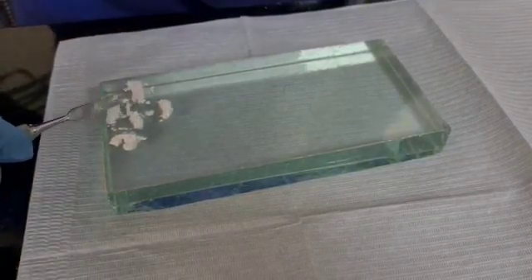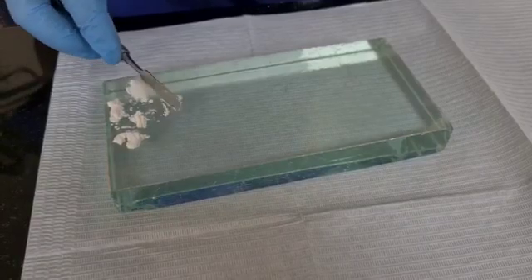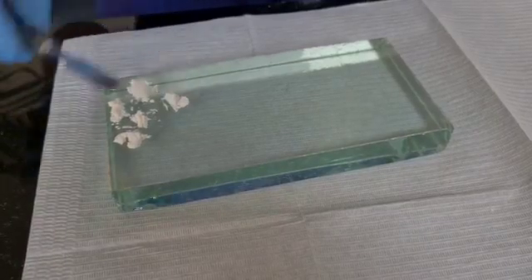This powder can be replaced in the bottle if it has not been contaminated.